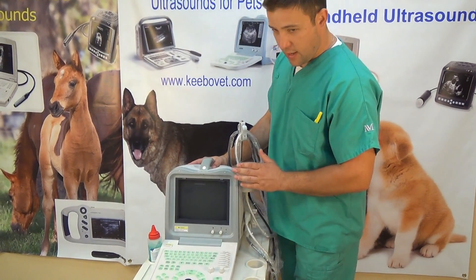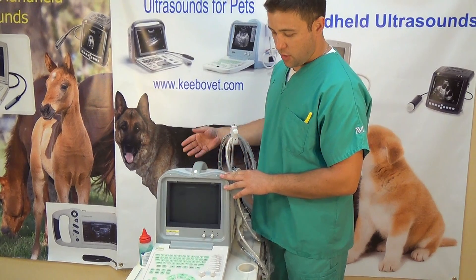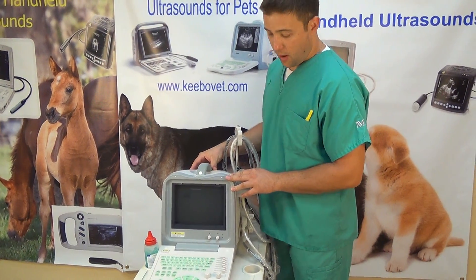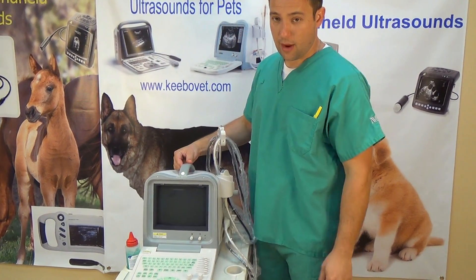Specifically, this machine has a 10-inch screen. There's a USB port for saving images and files. You can also hook this up to printers for printing images on site. You can also save internally if you're out and about and can't print or save at the time.